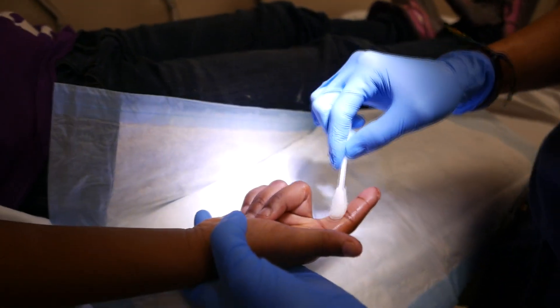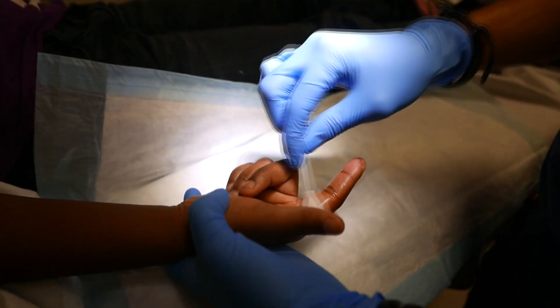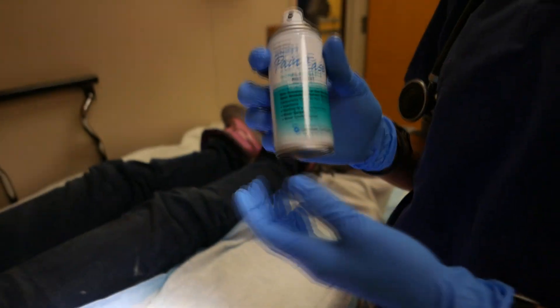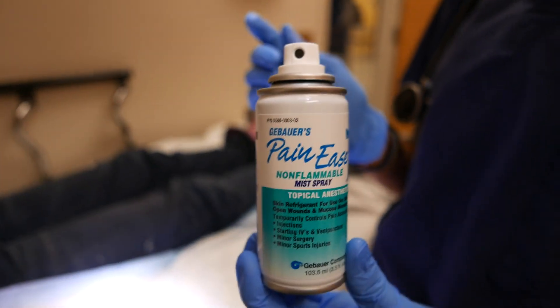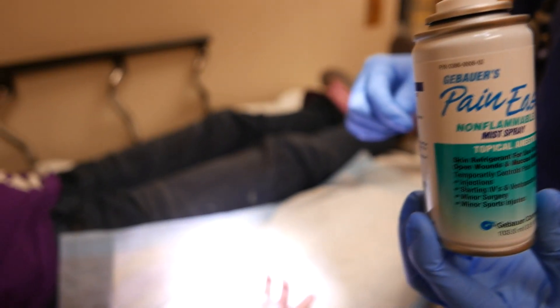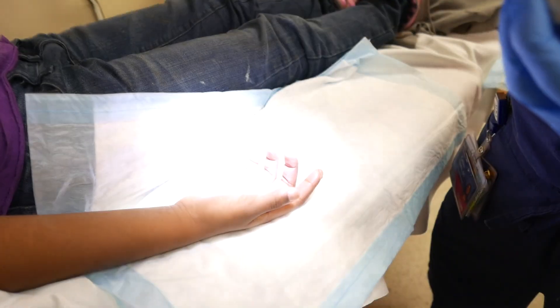So this is just freezing stuff, okay? It's gonna make your finger feel really cold. It might burn a little bit, but then hopefully you don't feel the needle stick. You need your dad over here?